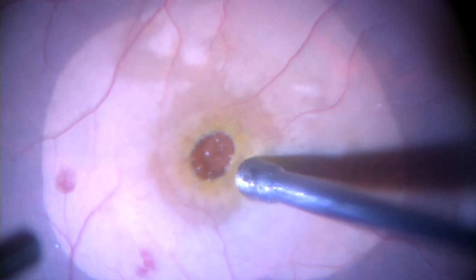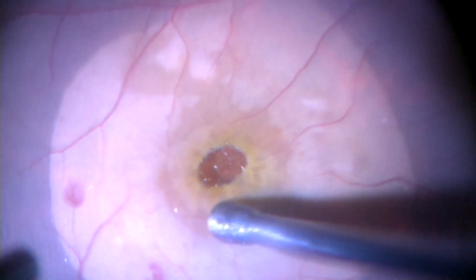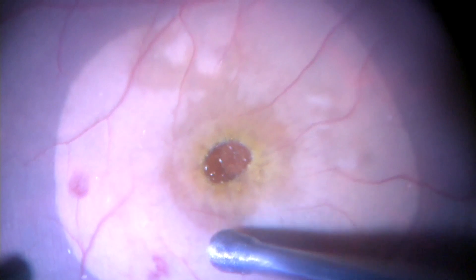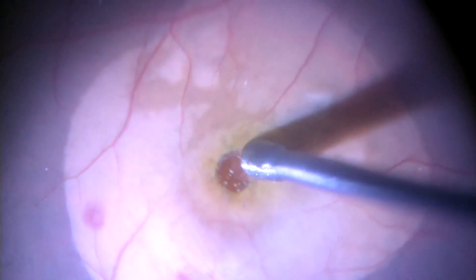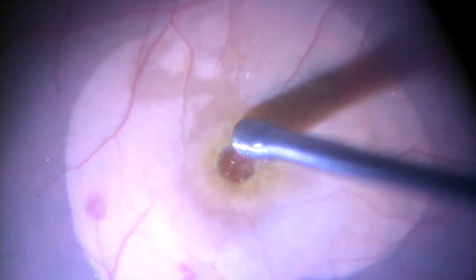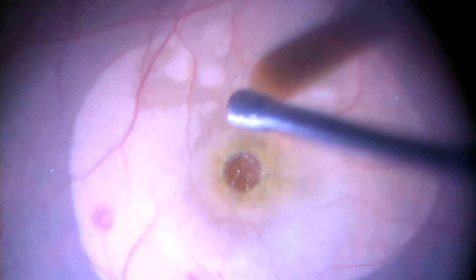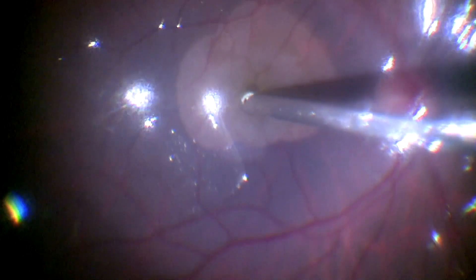This is another example of a large hole where we use the retinal massager in a similar manner. Once air fluid exchange is completed, we can see that the hole becomes smaller.